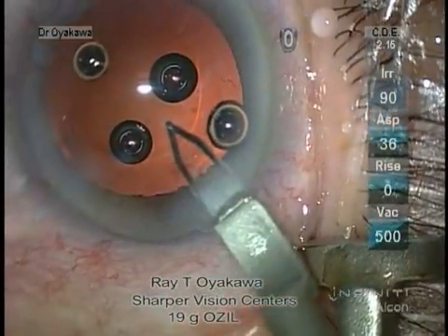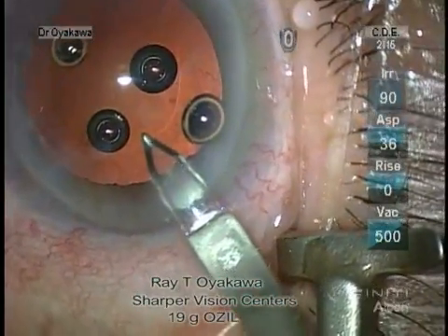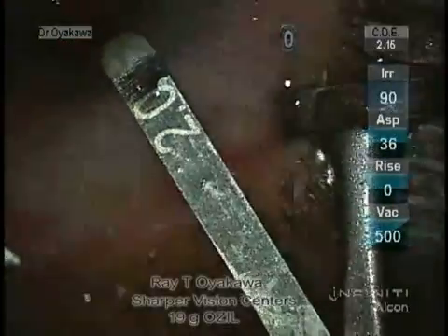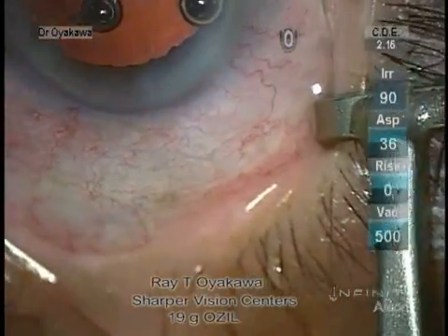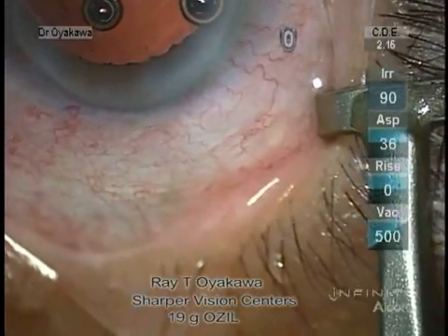I'm going to be showing the insertion of an Alcon SN60WF lens through a two millimeter or less incision. All the surgeries were done with bimanual technique using Ozil. As you can see, the wound there was just about at two millimeters.